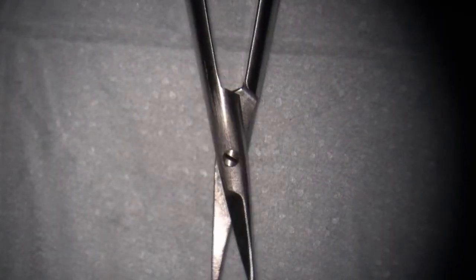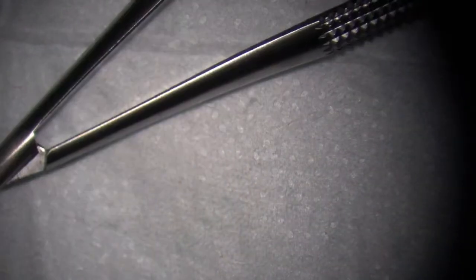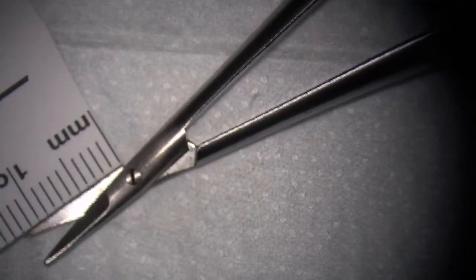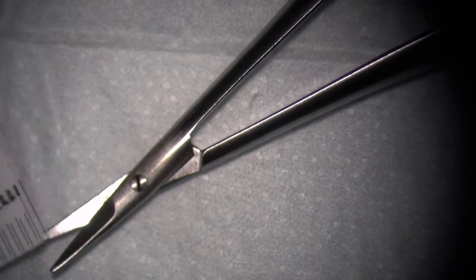So this F and 12 are a little bit new. We didn't see them on the other instrument. This F is the 5 blade, so that means the blade is even smaller, for super microsurgery. And 12 means the length of the blade is 12 millimeters, from the tip up to the joint.